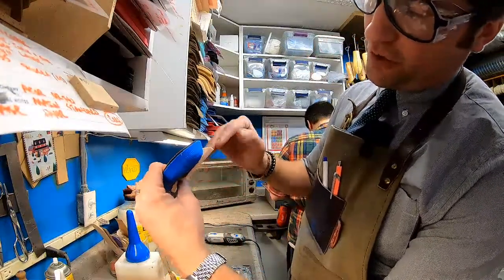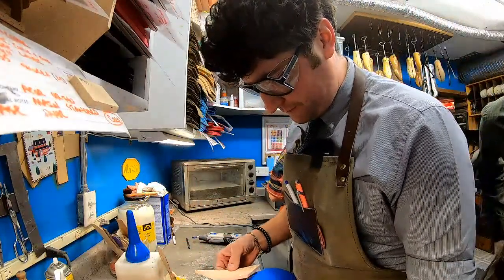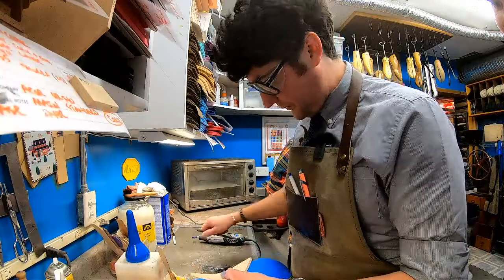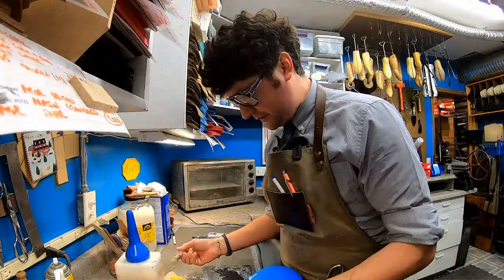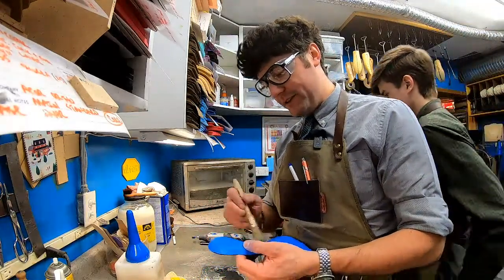Now we gotta make sure that we square this off properly. So I got 2 layers of 1/4-inch P-cell, and when we do this, we want to square this off. So let's get the glue on the P-cell. That's ready to go. It's like a cooking show. You gotta have the steps ready to go.